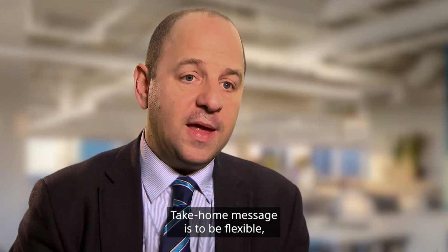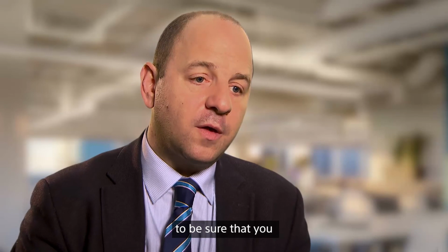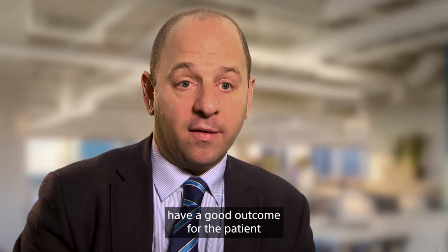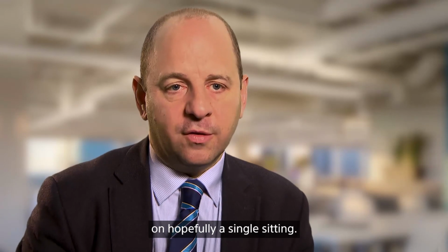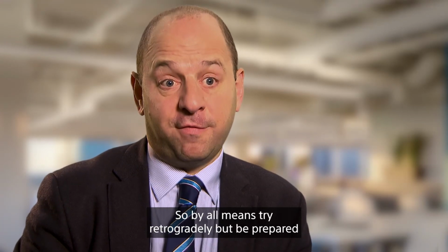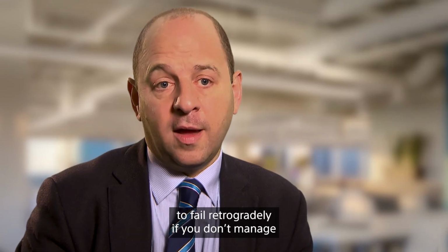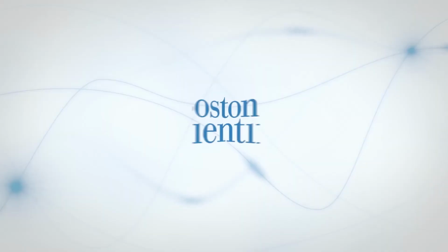Take-home message is to be flexible, to be sure that you have a good outcome for the patient on hopefully a single sitting. So by all means try retrogradely, but be prepared to fail retrogradely if you don't manage, and think about an antegrade approach if it's required.